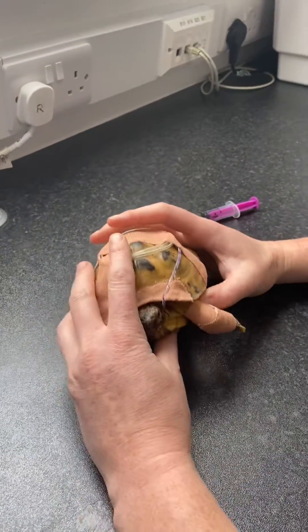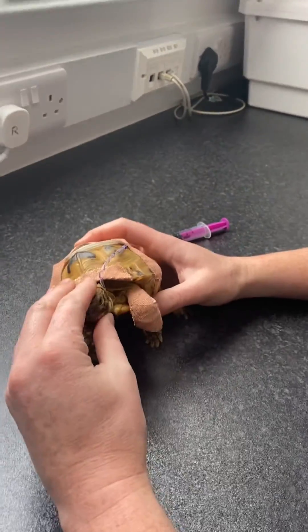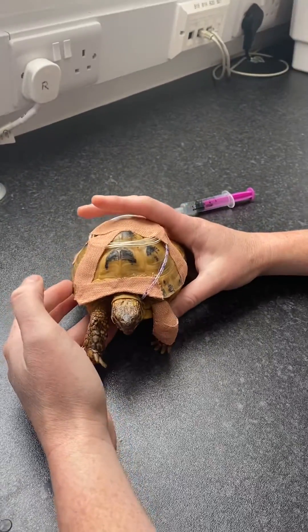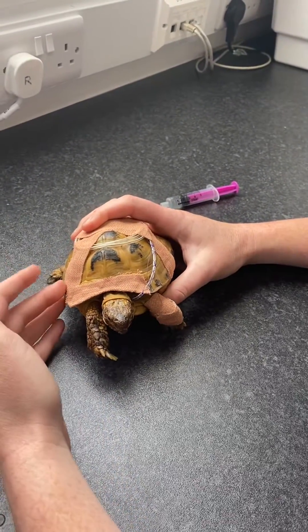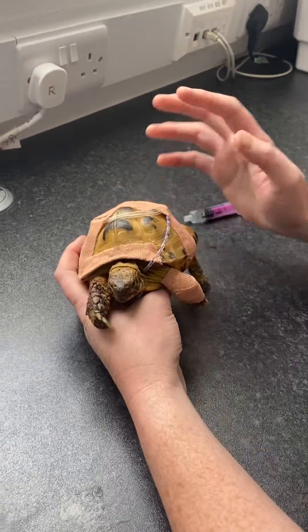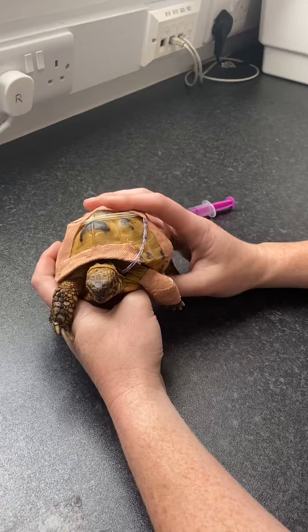Today we're going to take you through the care of an oesophagostomy tube or a pharyngostomy tube in tortoises. They have these placed for various different reasons. In awkward tortoises where you can't give them medications, it allows you to medicate them, or in tortoises that aren't eating, we can put a syringe feed down these tubes.